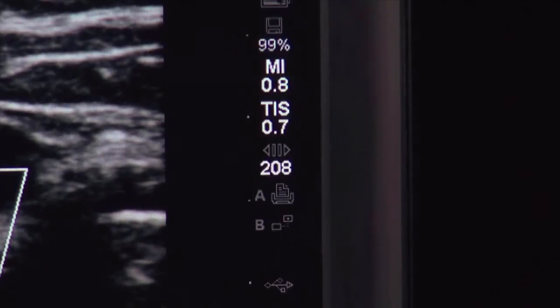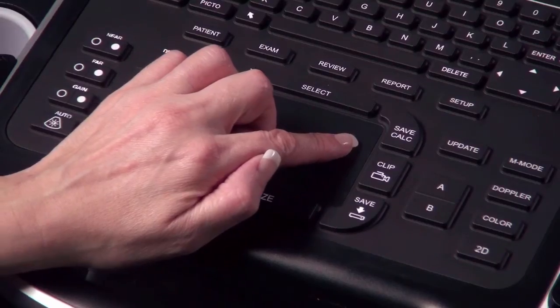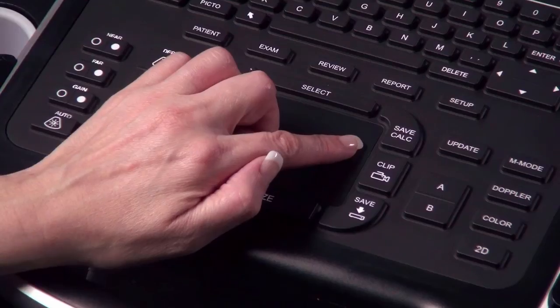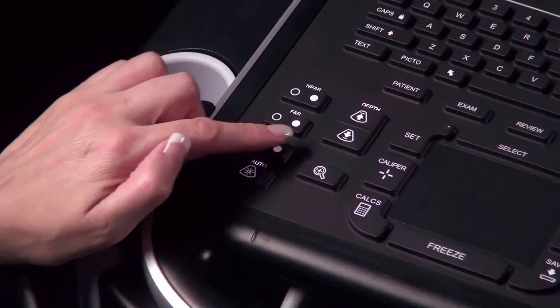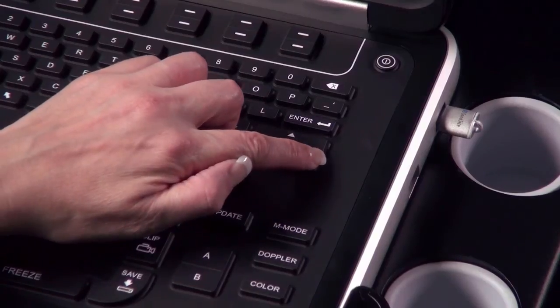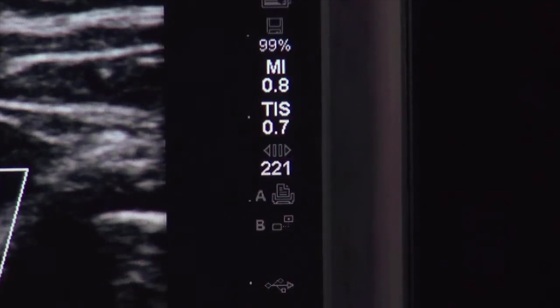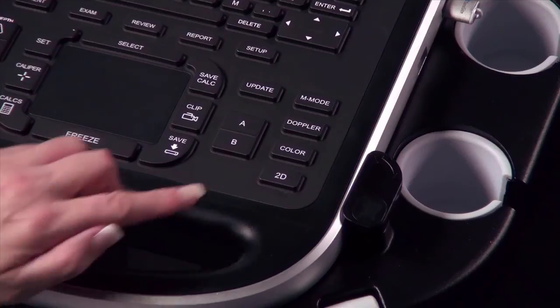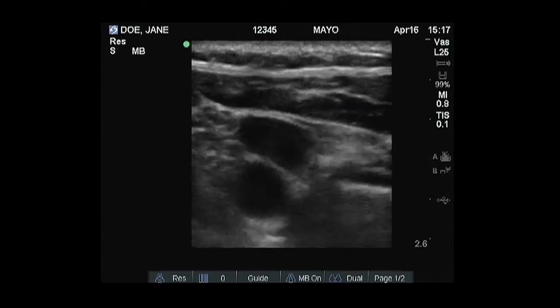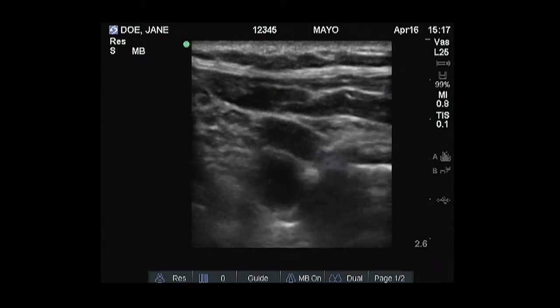You may freeze a color image to save or review individual frames in the cine buffer. Just as in 2D imaging, the cine buffer can be accessed using the touchpad, Gain key, or arrow keys. Press the 2D or Color key to return to 2D imaging.